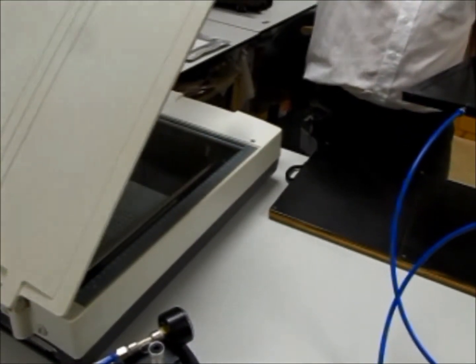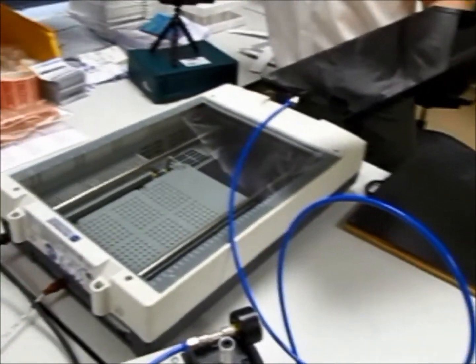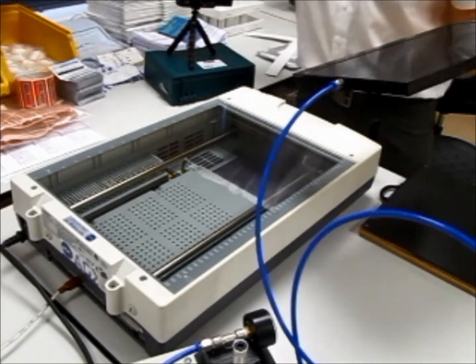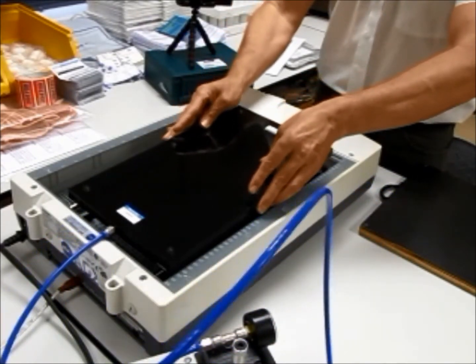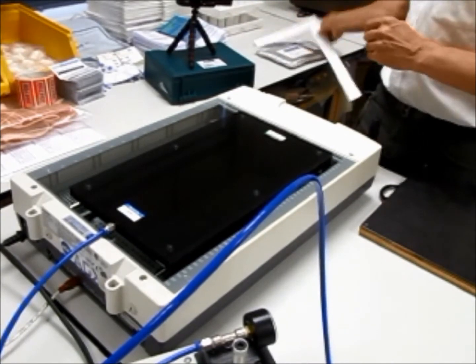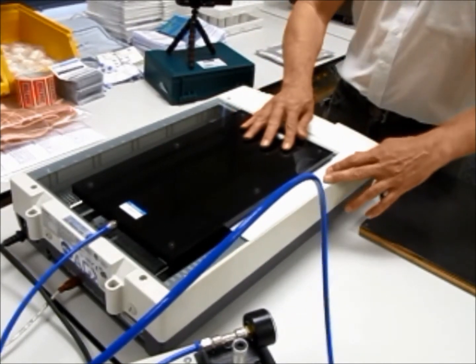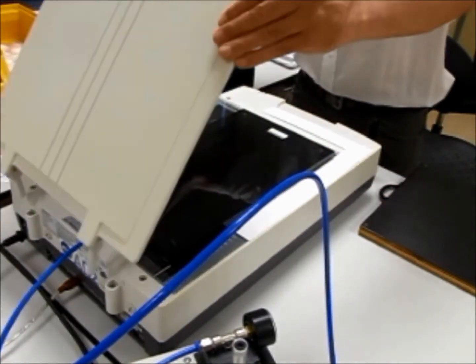So we'll demonstrate that now. Just position that over. We'll put a rule on there so we know it is square. We've got it aligned and held in place on the scanner.